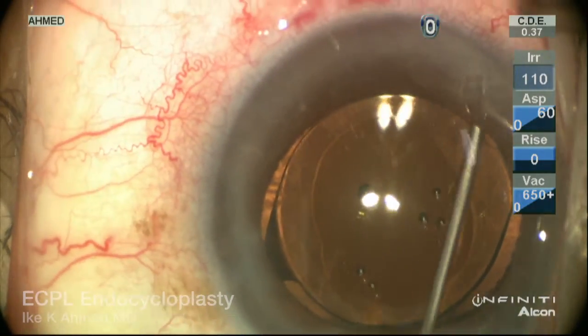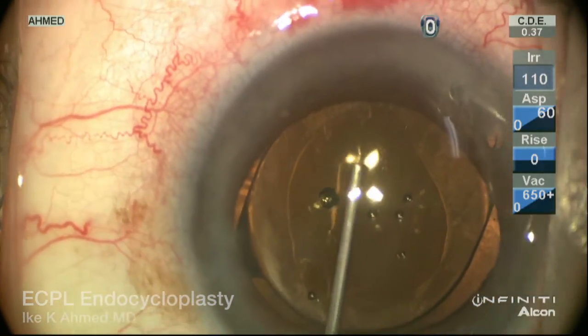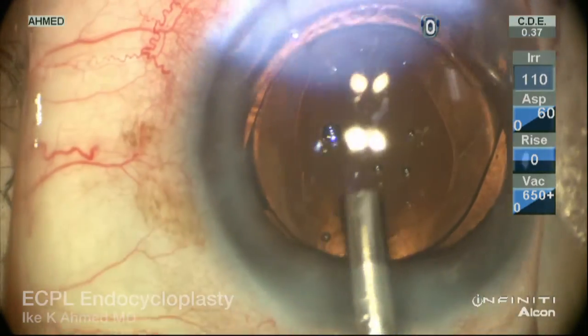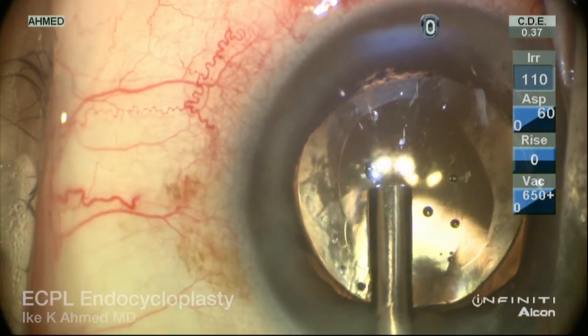This video demonstrates the endocycloplasty technique after viscoelastic has been injected and after the IOL has been implanted at the time of cataract surgery. The endoscope, which consists of a camera, a light source, and a diode laser, is used to ablate the posterior tail of these processes.